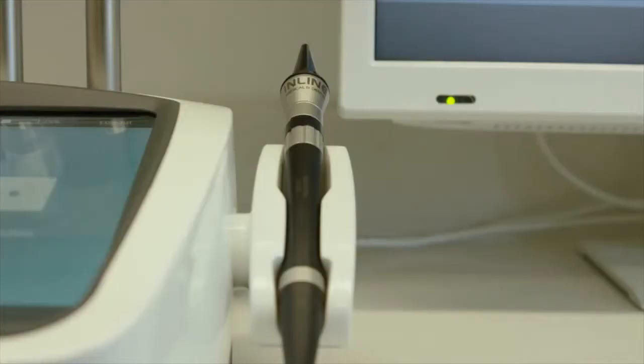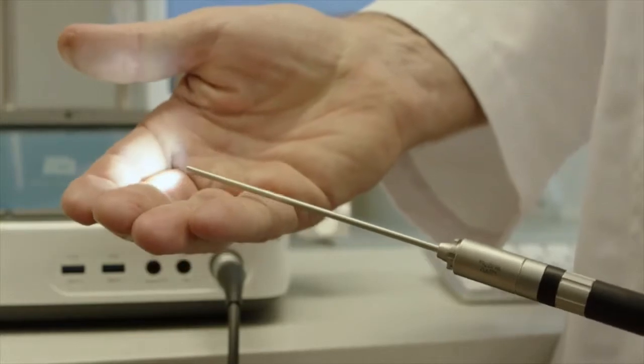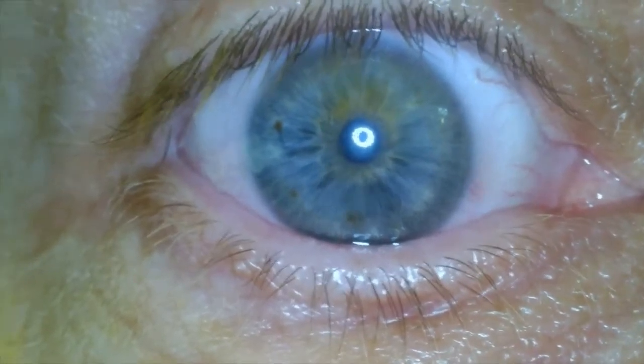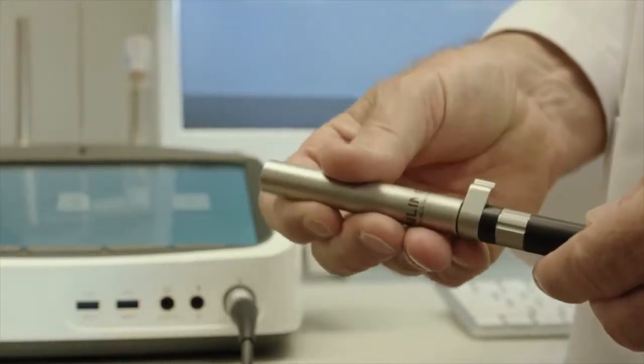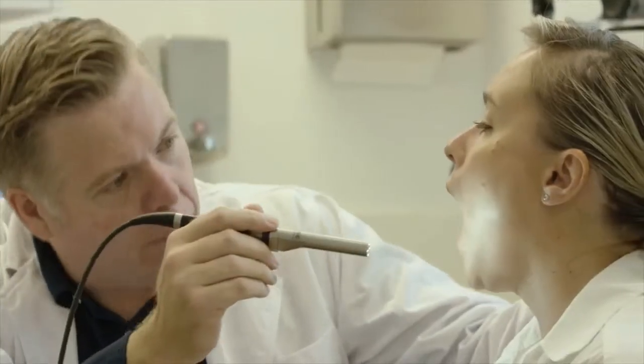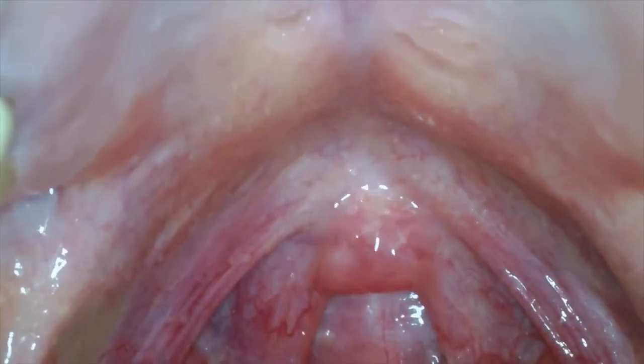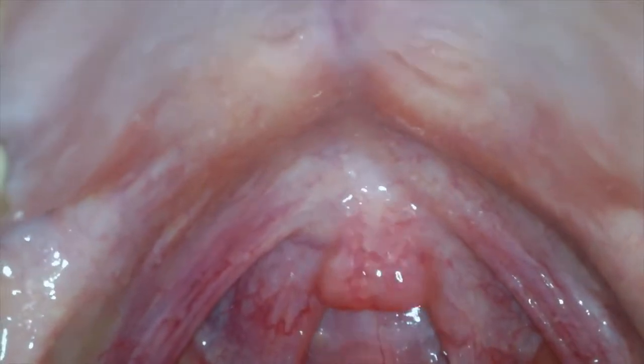The Pro-EX utilises state of the art electronics along with precision optics to produce the sharpest possible medical images. The general exam probe can be focused from a few millimetres to infinity using the focal wheel on the handpiece. The probe is ideal for imaging of the oral cavity or external lesions and wounds.